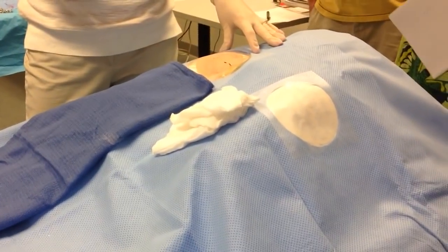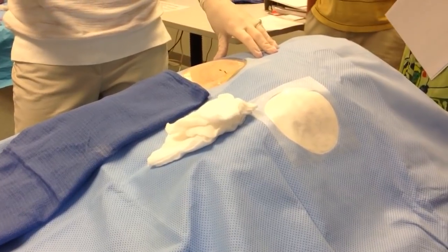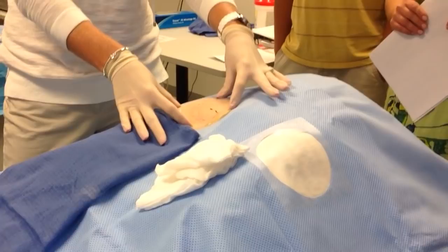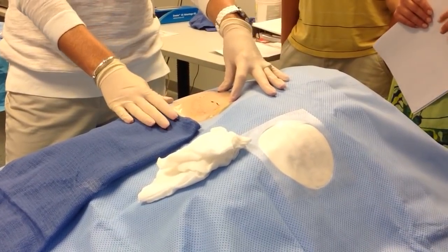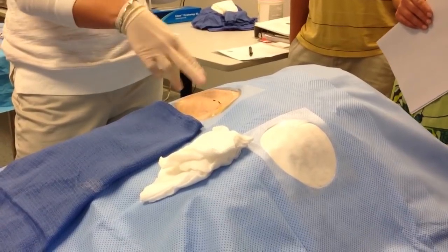Okay, we already prepped the patient. We brought the patient in and hooked him up to the blood pressure cuff, the EKG, and the pulse ox. This is where you want this circle to have the pulse right in the center of it. So you want to check all that before you prep the patient. Because after you prep the patient, you don't want to be touching.